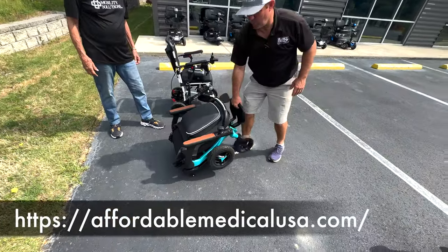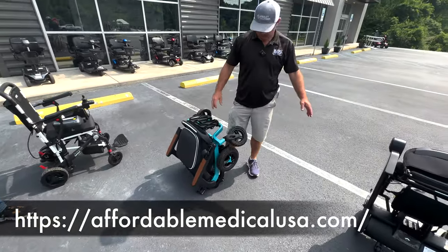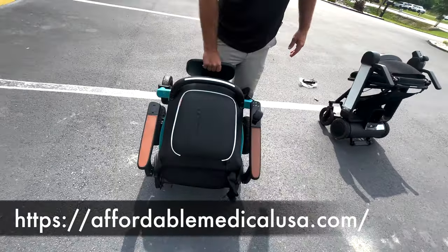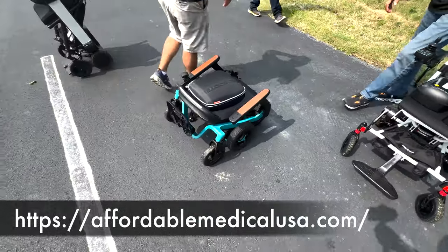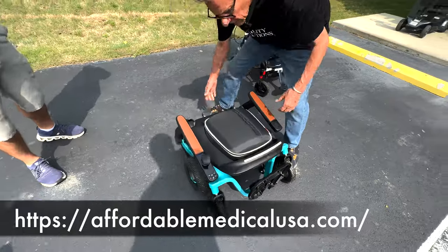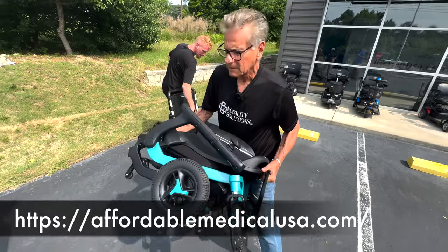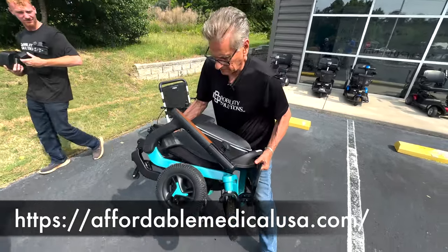So from here, just so you know, you can roll it and it stands straight up. So it's just as compact as that one is. All right, Eddie, pick this one up. Just pick it up. Yeah, that's not bad. This is not bad at all. It feels like about 40, what is it, 45? 49 without the battery, they say.